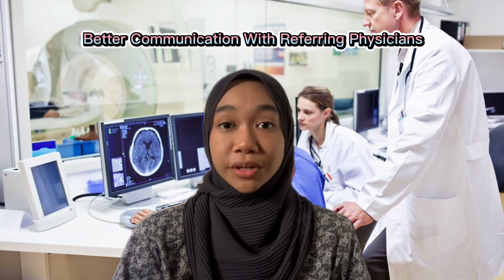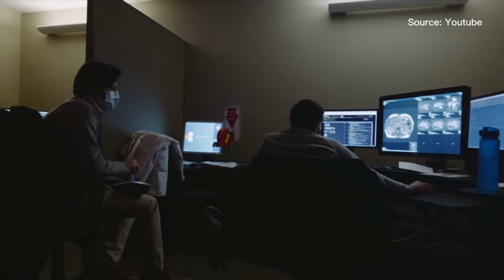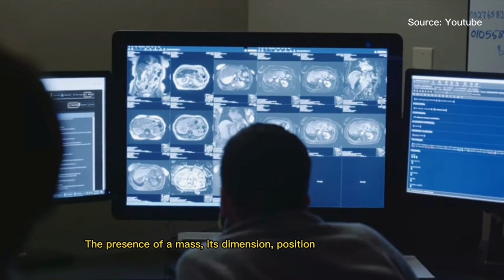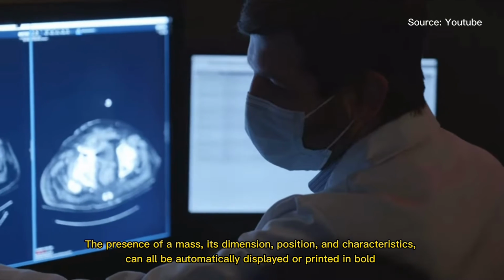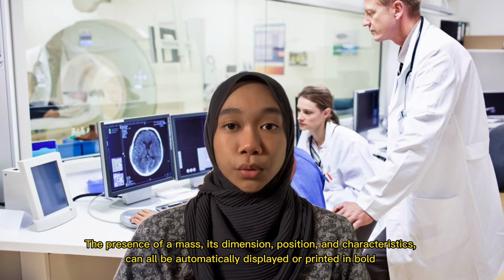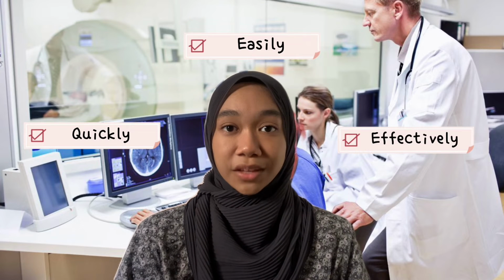Dicom technology offers many advantages, including the fact that it provides better communication with the referring physicians. Referring physicians prefer to read an organized report. Structured reports can be both brief and in-depth. They are easier and faster to read, especially when key structural elements are highlighted. For example, the presence of a mass, its dimension, position, and characteristics can all be automatically displayed or printed in bold to communicate important information to the reader more quickly, easily, and effectively.